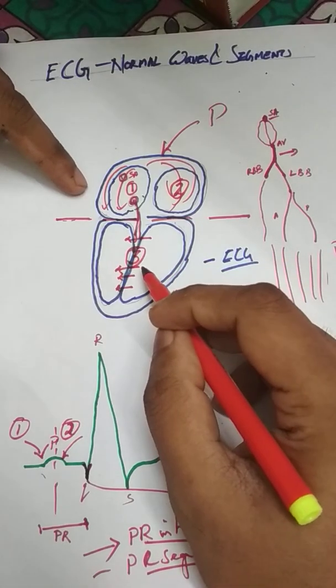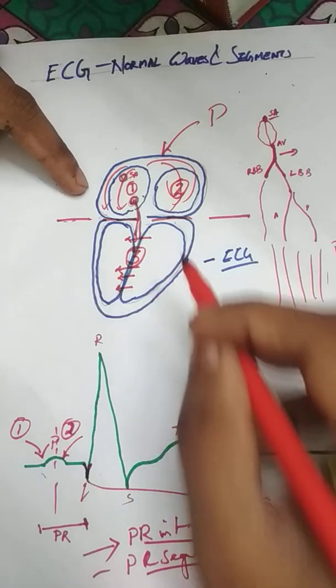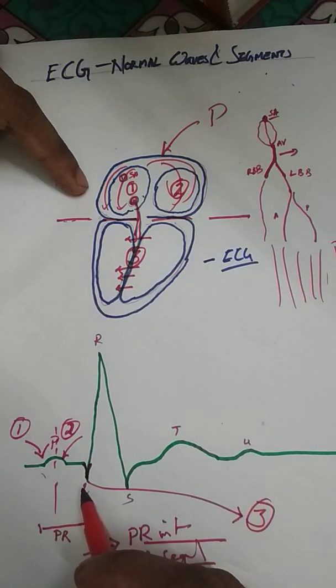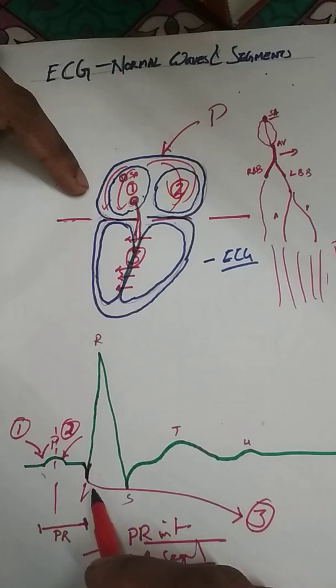So the depolarization of the septum gives the third wave.